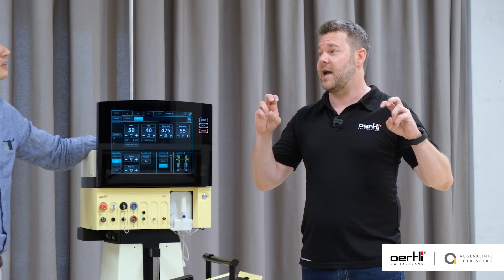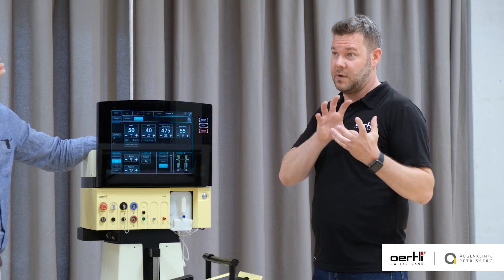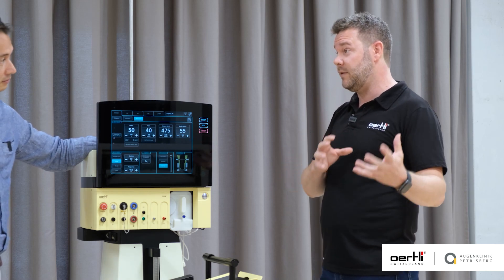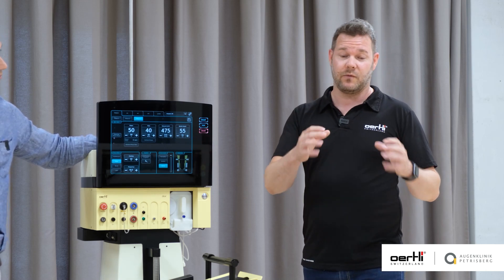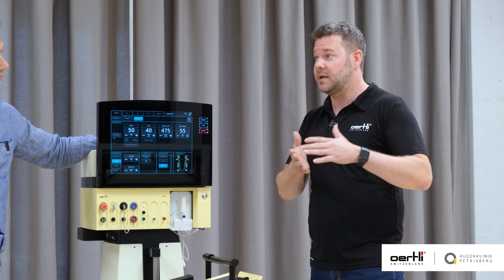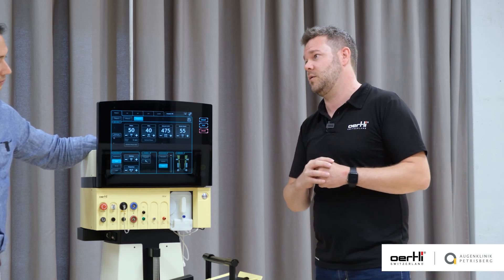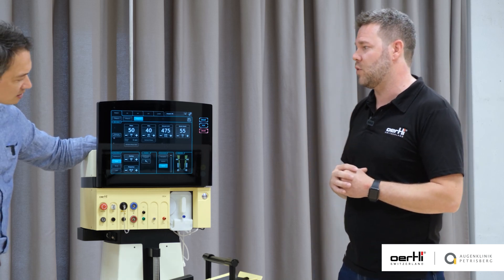So you need to be very careful with that. With a peristaltic pump you need to approach the fragment and have occlusion to create the vacuum and pull it back. The event horizon on the Venturi pump is bigger, so you can attract fragments that are further away from your instrument. With the peristaltic pump, fragments or membranes need to be closer to your instrument to get proper occlusion.